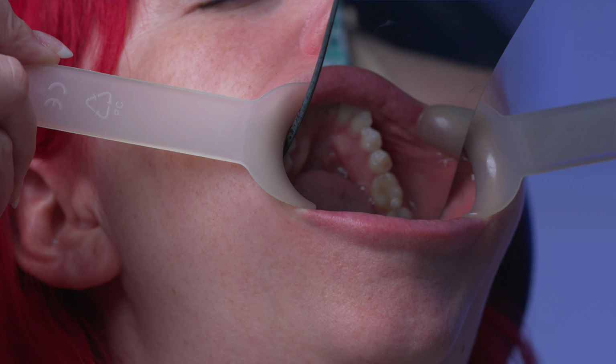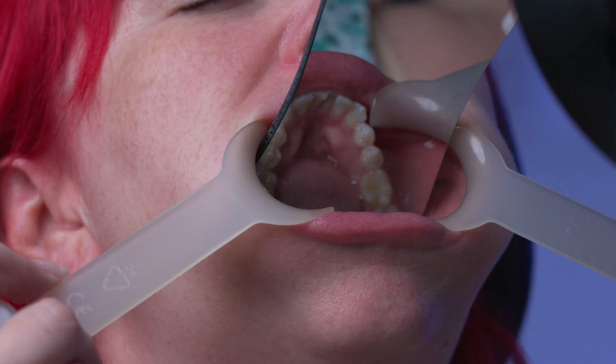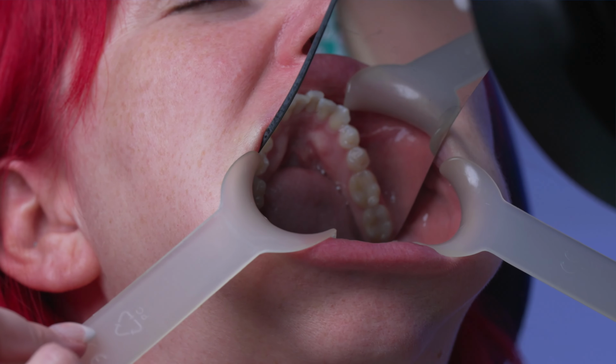If you're wanting a more lateral perspective, then you would aim to have the first molar perpendicular to the camera plane, which will likely require alternative retraction. For the mirror shots, you are aiming to have the full occlusal surface parallel to the camera plane.